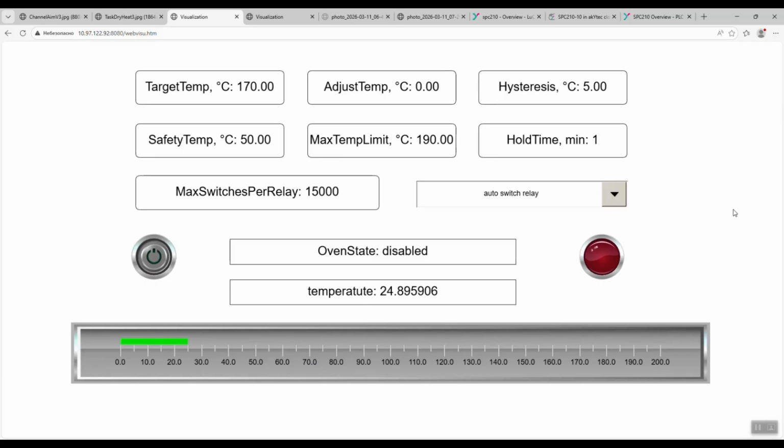In addition, you can set other parameters, for example the hysteresis, which is defined relative to the target temperature. There are two limits. When the upper limit is reached, the heater should turn off. When the lower limit is reached, it should turn on. Right now, we can see that the temperature sensor in the sterilizer is showing 25 degrees Celsius. Let's press the button and watch the process speed up.